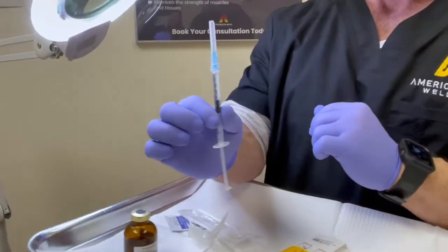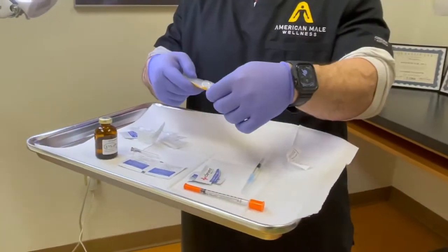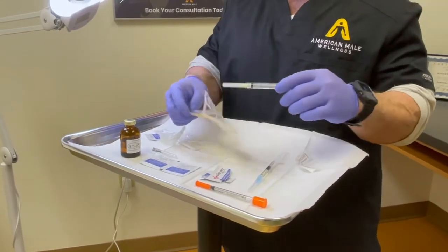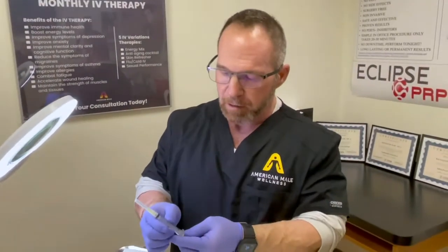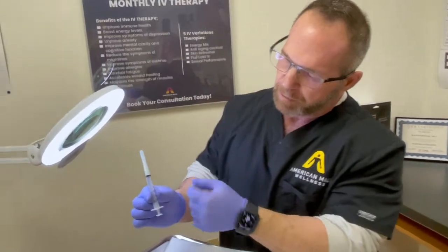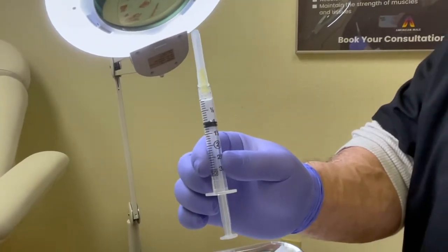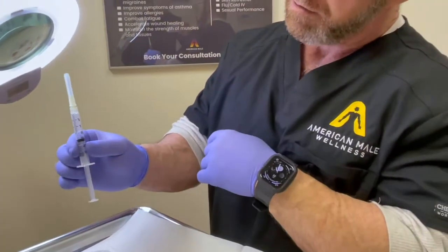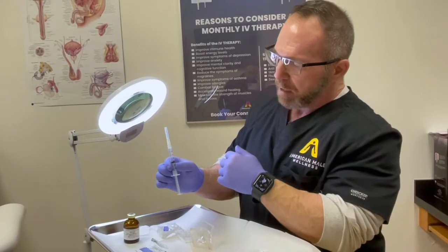For anyone using over 1ml — say your testosterone is 50 milligrams per ml and you need 100 milligrams per week — you'd need to draw 2ml, which won't fit in a 1ml syringe. This 3cc or 3ml syringe has a larger circumference, which allows for more volume to be drawn.